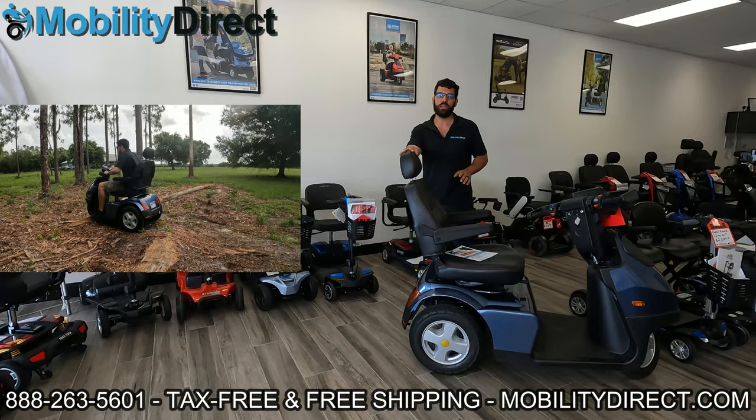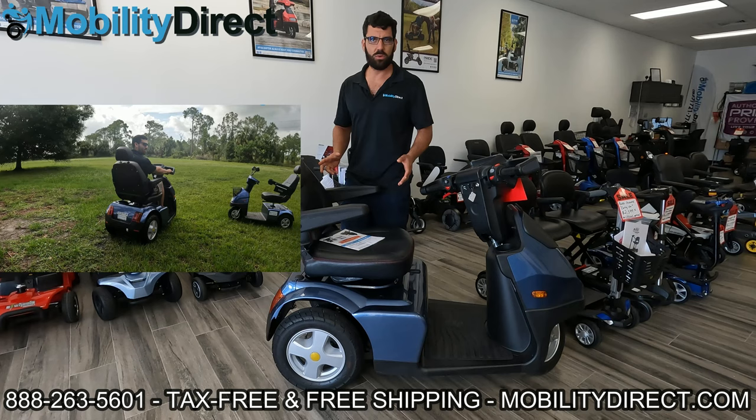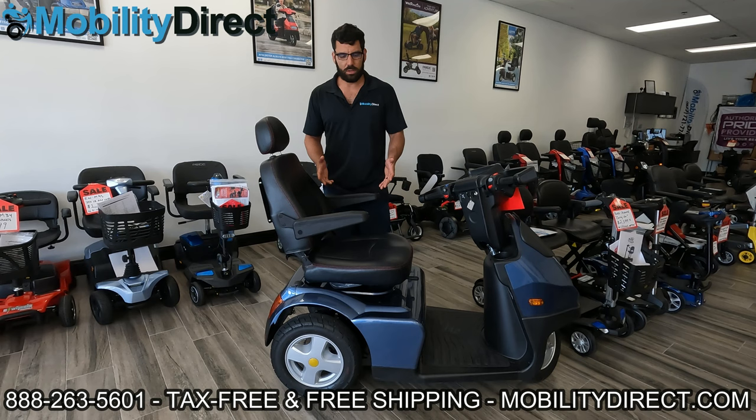Now we're going to get started with the video. Here we have one of our top-selling scooters — it is a beast, an off-road beast that can handle almost any kind of terrain. We're the number one volume dealer for the Afikim scooter. What you're looking at is the Afi Scooter Model S. It doesn't really matter which scooter you have — most mobility scooters, about 95% or more, have the same type of seat mounting setup, and I'll explain all that in just a moment.